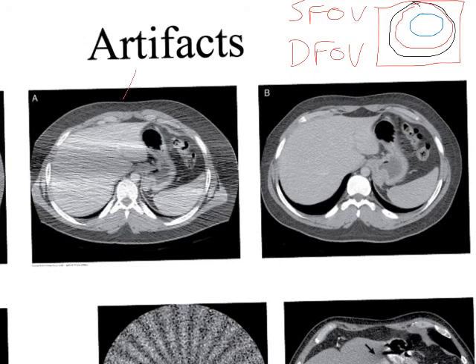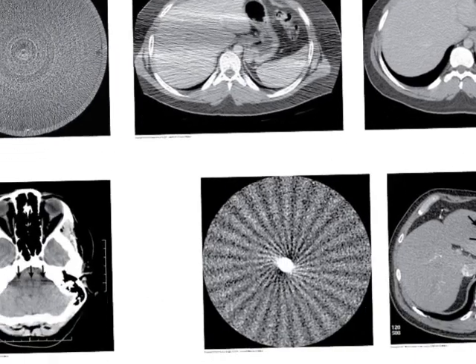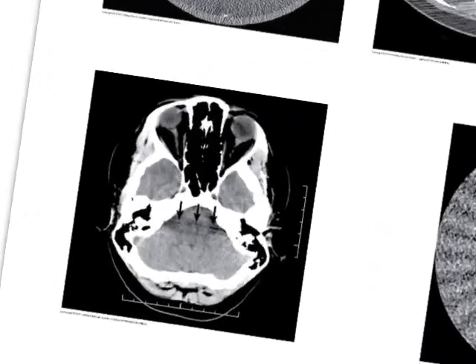Question? So on the scan field of view, is that pretty preset on each machine? Yes. It has a certain set, can't change it, scanning field of view. And yes, we have control over the display part. You do. Okay. There are some exceptions to that, but for the most part, yes. Okay, good questions. All right, let's come down here and look at this image.